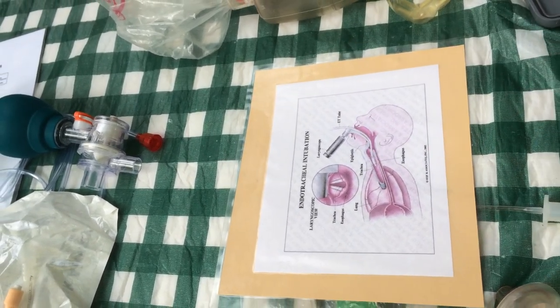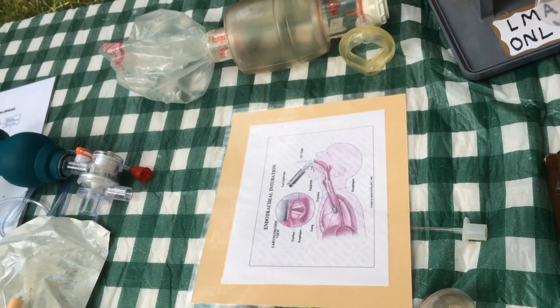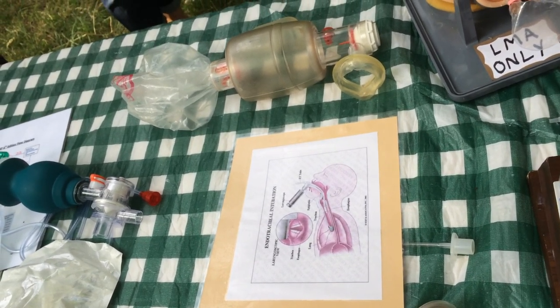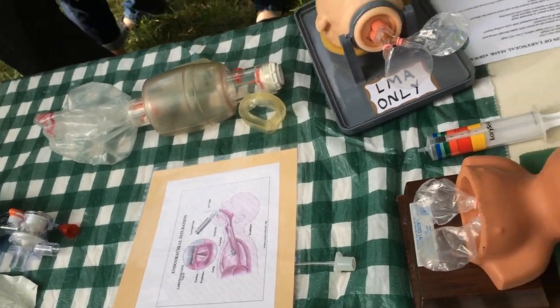So when you are handling this and putting it in, you need to remember which way you have to put it in. It's always in the shape of the baby's airway, okay? So you've got your baby's airway. You might want to put a little towel under your baby. Obviously these babies don't need that.